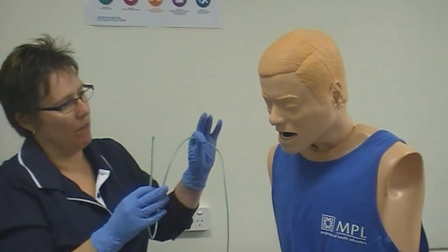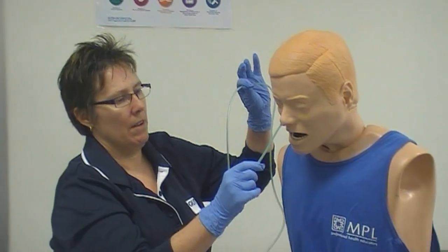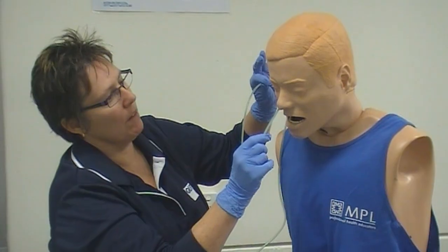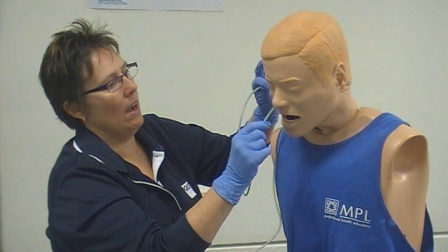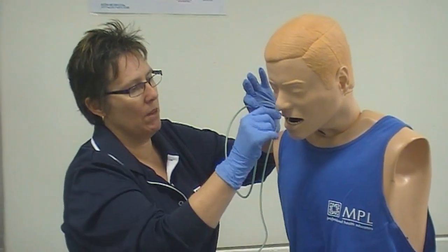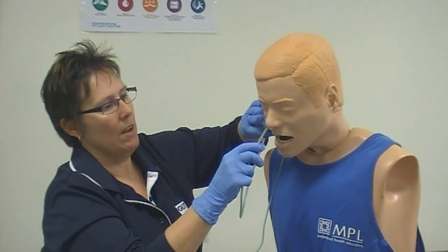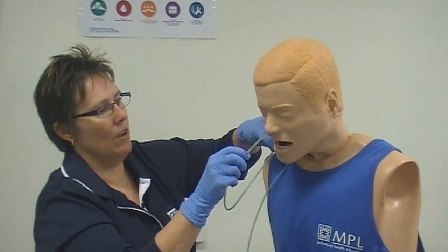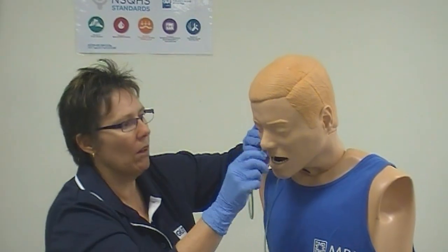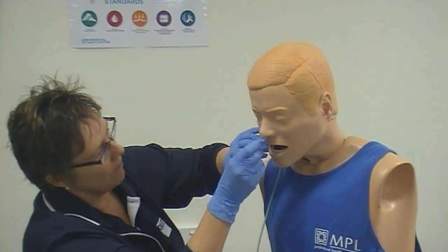I come to my patient, who is positioned nicely with his mouth full of water. I'm going to start progressing into the nostril. When I get in here I'm not pointing up and I don't want to be pointing straight back — I want to just hook it nicely so it progresses. This doesn't feel too bad for the patient at this point; it's when we hit the gag reflex and the epiglottis further down. My patient has his mouth full of water, so if he can help me I'm going to say 'swallow, swallow, swallow' as I advance the tube.